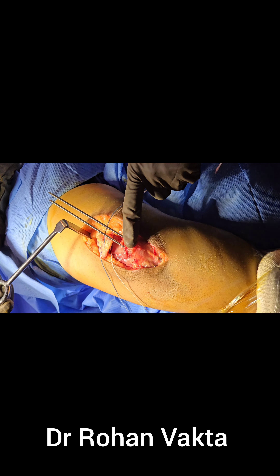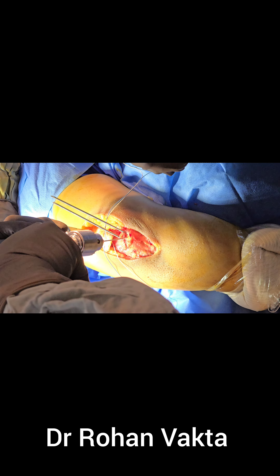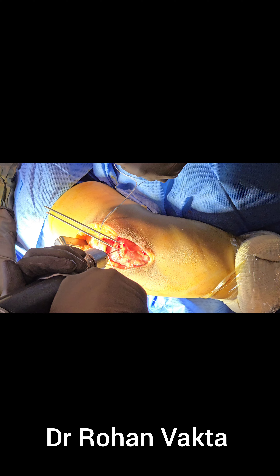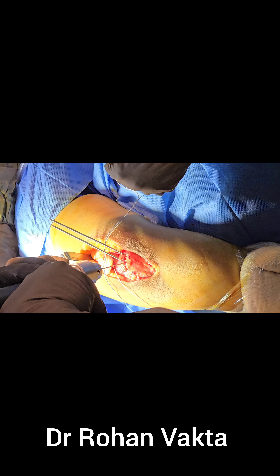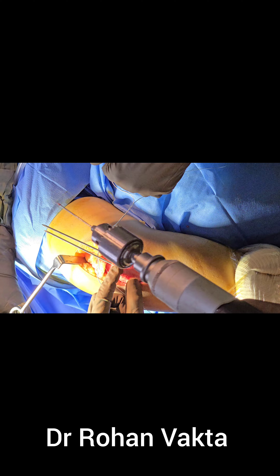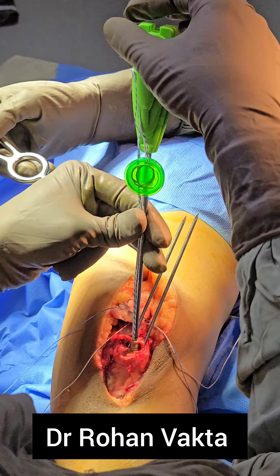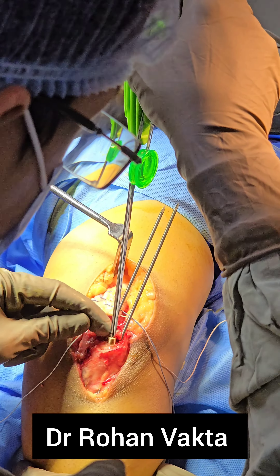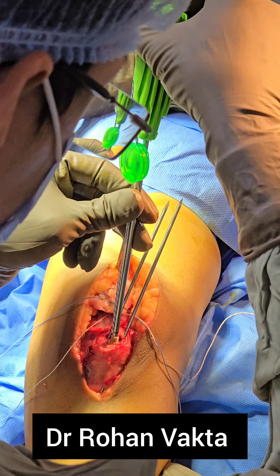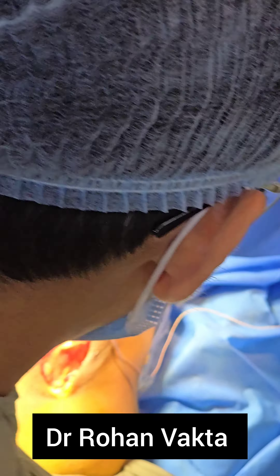In this video we will show transosseous repair along with use of a suture anchor, so a hybrid technique will be used for robust repair. Medially and laterally, two K-wires are used. A 1 to 1.5 mm K-wire is used to make multiple drill holes to increase bleeding. In the center, one suture anchor will be placed — a 5.5 mm PEEK double-loaded suture anchor with a pre-loaded needle attached to the fiber wire.